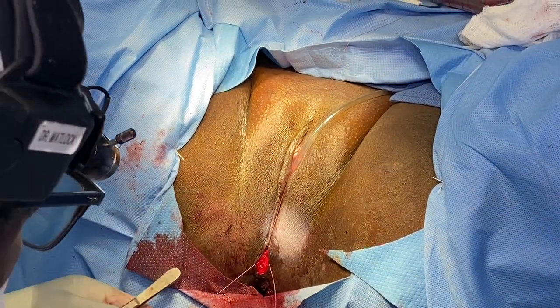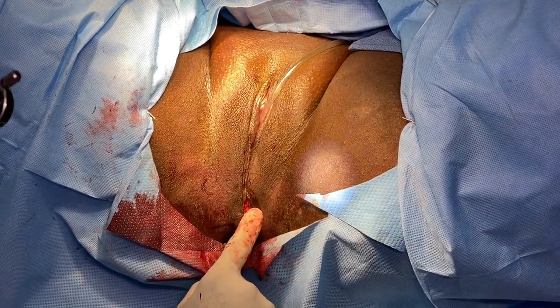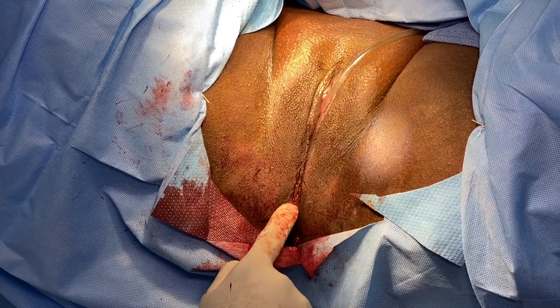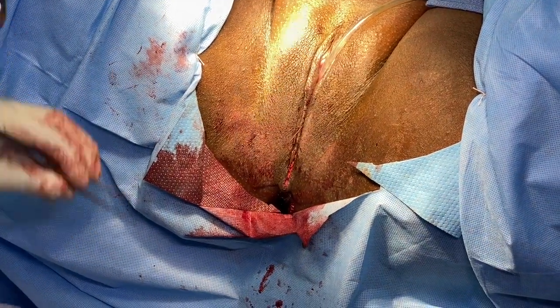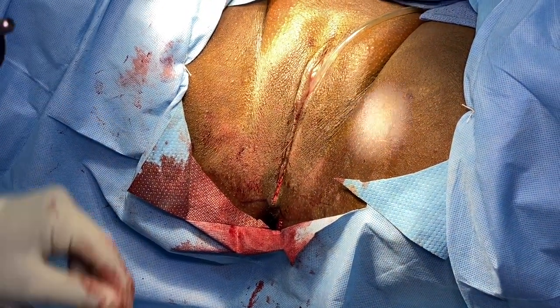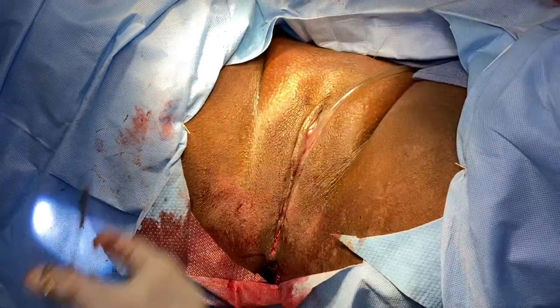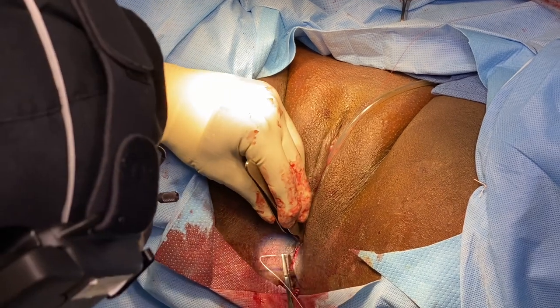We'll bring you back in. We have the superficial and deep transverse perinei muscles back together. This is the support of the perineum. Now we're going to build up the fascia, the soft tissue here. Small needle holder from now on. We'll do a fine closure totally.